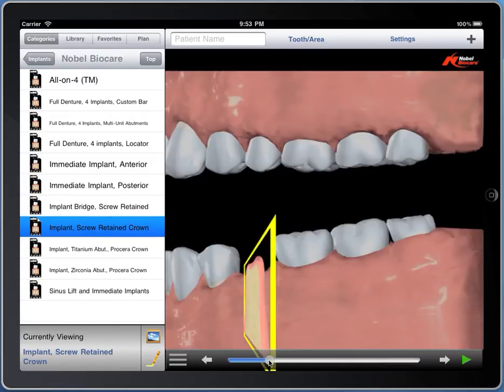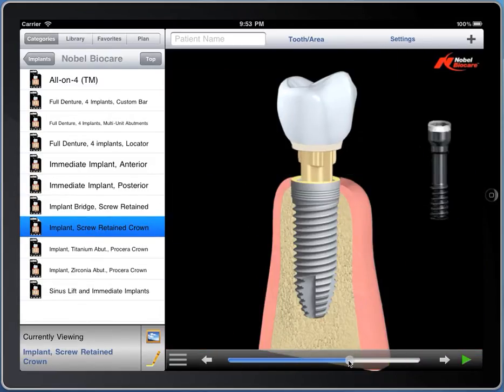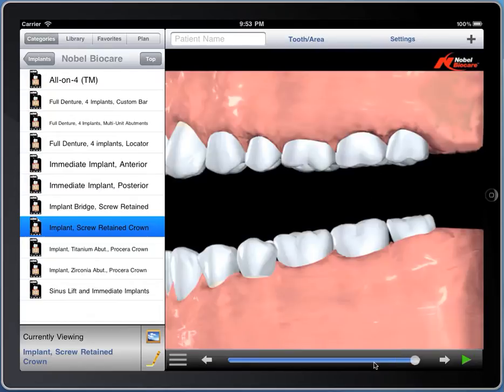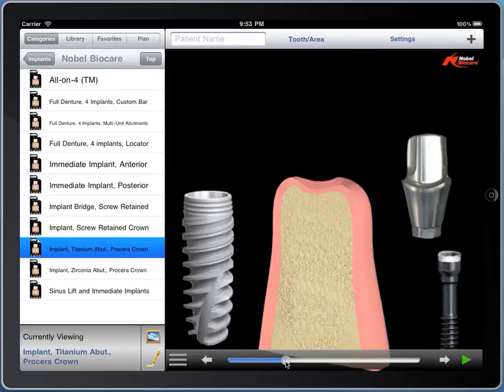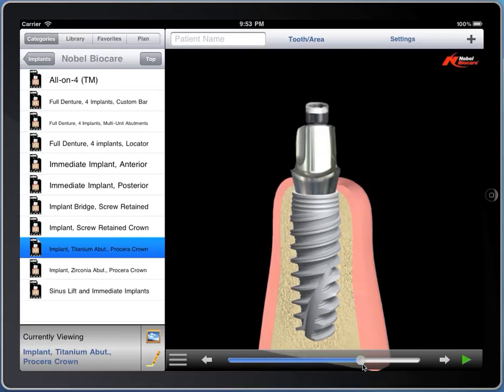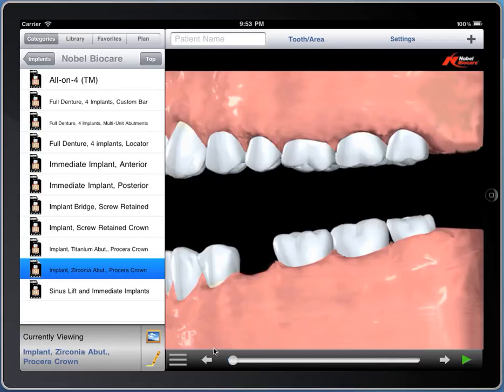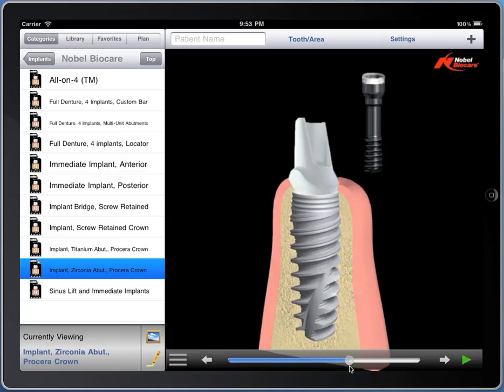Here is a screw-retained single unit implant. This is a standard cementable titanium abutment implant. And the same thing with a zirconia abutment, which is a good way to show your patients the options and how it's going to look at the edge.